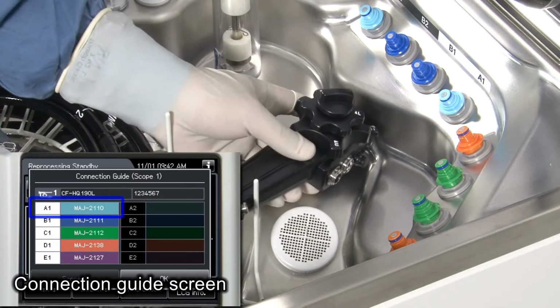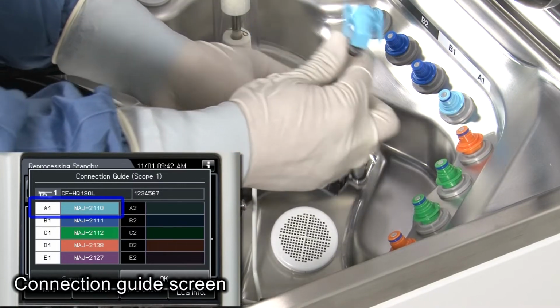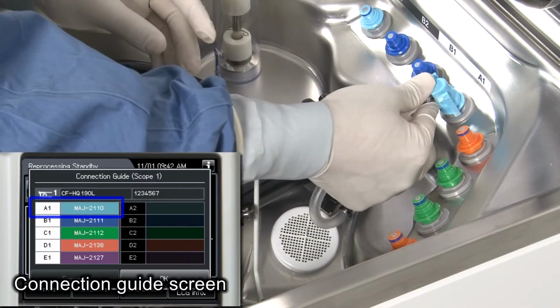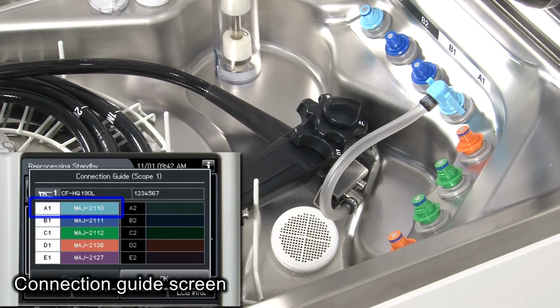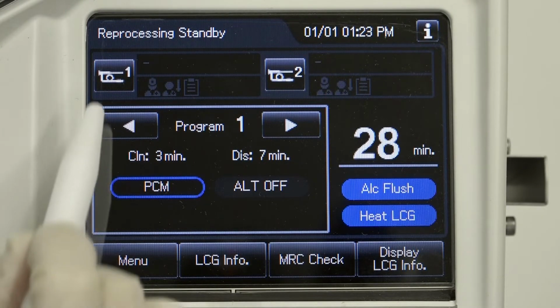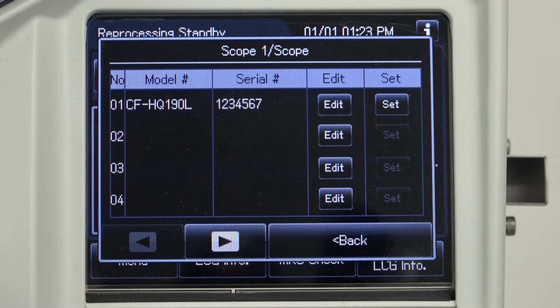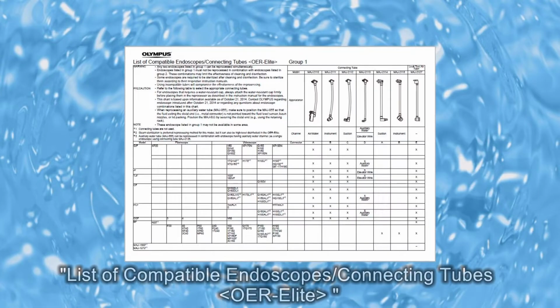Select the connecting tube that matches the endoscope by referring to the connection guide screen. Be careful not to kink the tube. Disconnect any unnecessary tubes. If scope ID is entered by the software keyboard on the touchscreen, select suitable connecting tube by referring to the list of compatible endoscopes connecting tubes.